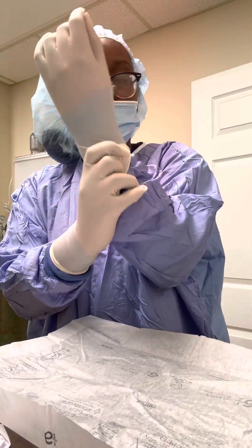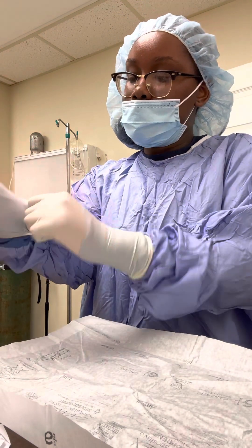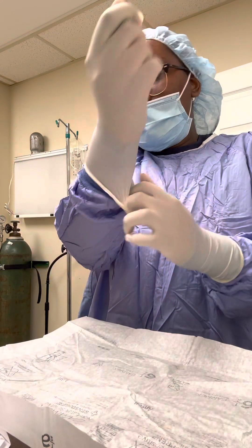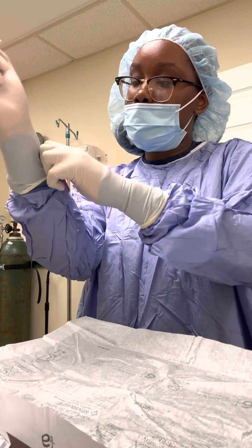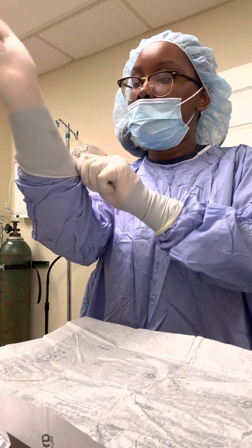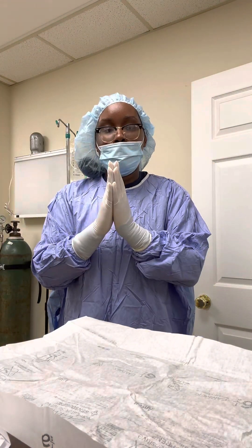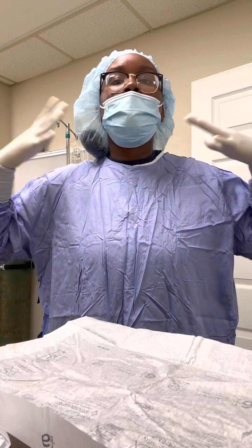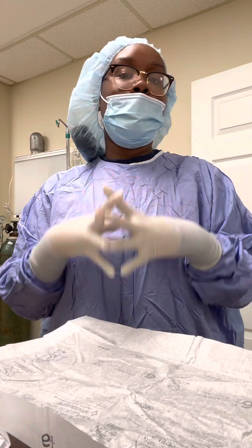Cover those tools so they can be sterile. I'm trying to maintain sterile field. And now, make sure they're covered — and they are covered. And that is how you correctly cap up, mask up, gown up, glove, and hand scrub for a surgical procedure. I hope this was done correctly.